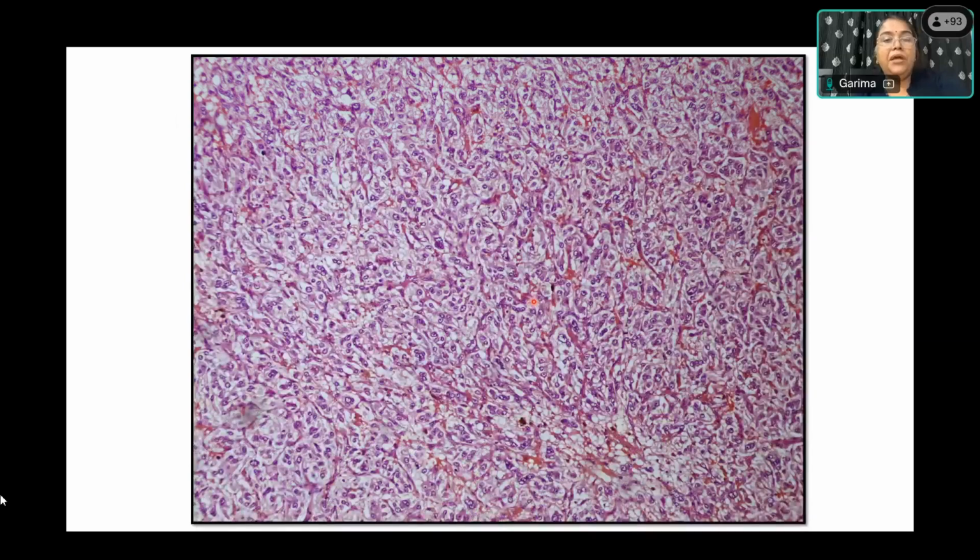Now here you can appreciate the morphology of the cell. Can you describe the morphology of this tumor? These are polygonal cells and they have abundant pale cytoplasm, and a centrally placed round nucleus with salt and pepper or stippled chromatin. Okay, and kind of prominent nucleoli. So this was a pretty straightforward case, right?